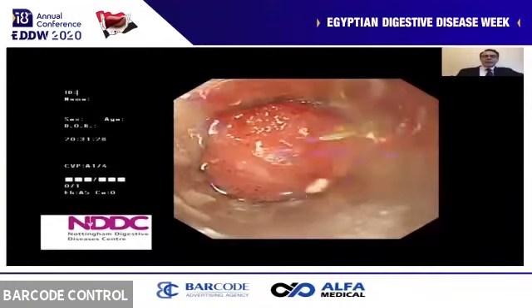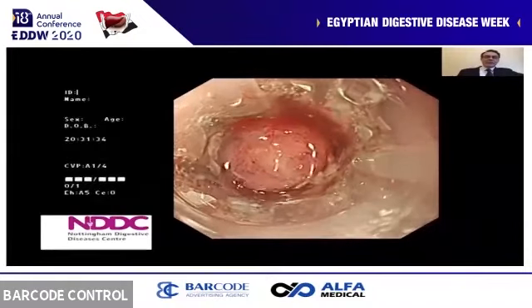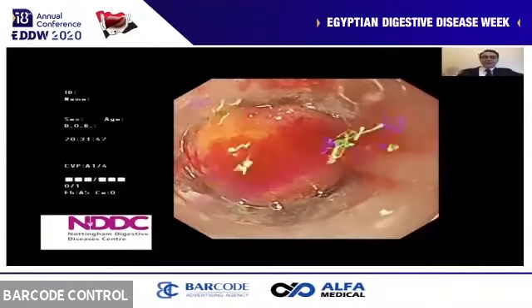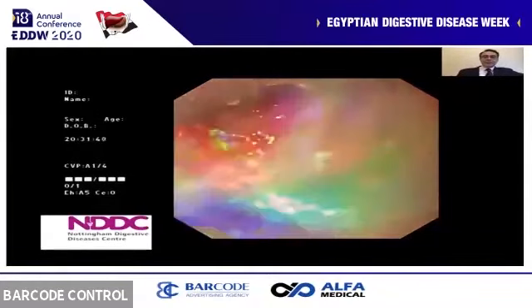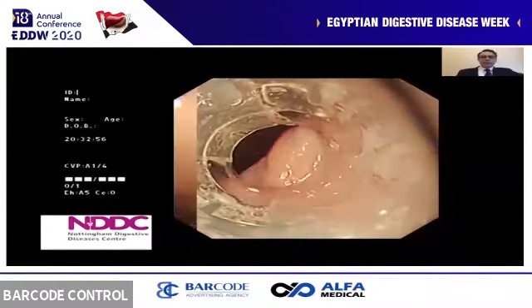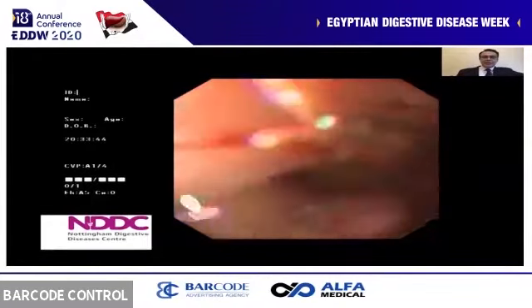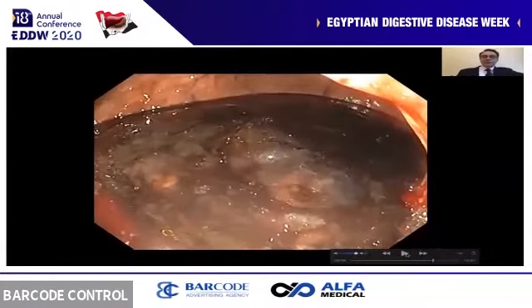And by using suction, this could have resulted in bleeding. Fortunately, it didn't. What happened now is that in order to deploy the padlock, the assistant has to press a button and they didn't have enough strength to do it. Another one had to take over and push a bit harder. And now the clip has been deployed, and we will remove the cap and make sure that it has worked. Over-the-scope clips should be in our armamentarium for the treatment of non-variceal bleeding. They can be life-saving tools. We can see that the ulcer is there, but the clip was deployed.